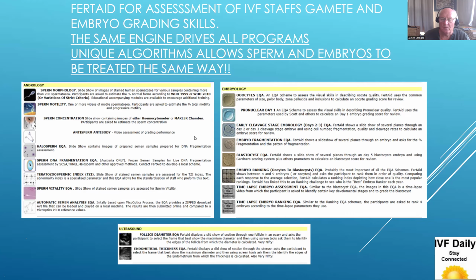But I use the same system to look at embryology: oocytes, pronuclear, cleavage, fragmentation, blastocyst EQA, rank embryos or oocytes to blastocyst 1 to whatever, just seeing how well you can rate them compared to everybody else. I've done that both with static images and with time lapse, both for assessing embryos with time lapse or ranking embryos by time lapse. I also, as I said before, run a thing for estimating follicle diameter, which I think is unique in the world.